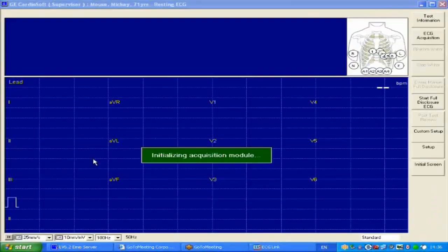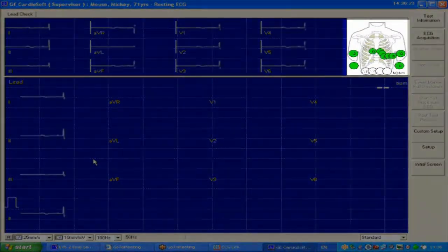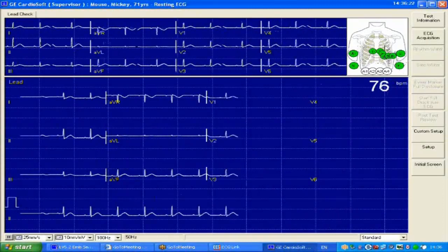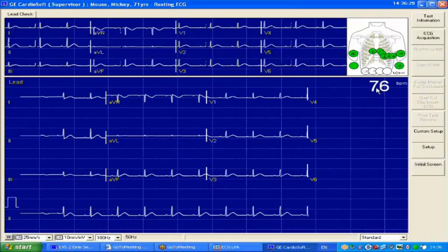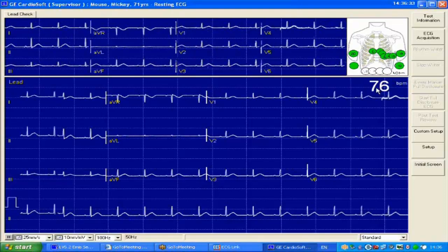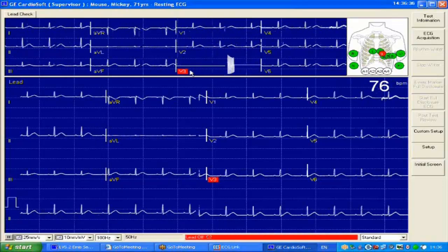You will see the ECG monitoring. You will notice the hookup advisor showing that all electrode sites have a good connection. If any of the connections are of poor quality, this will be shown in red. Go back to the patient and adjust the appropriate electrode.